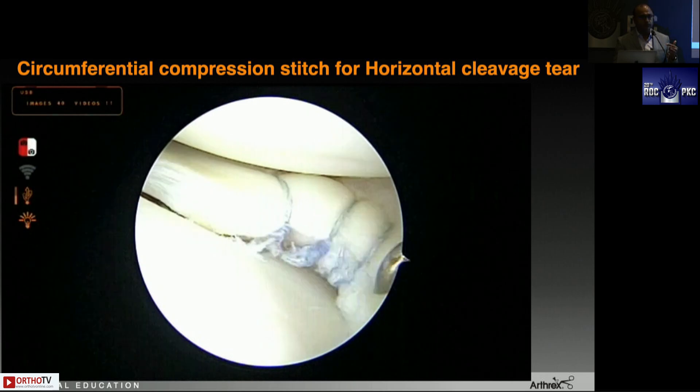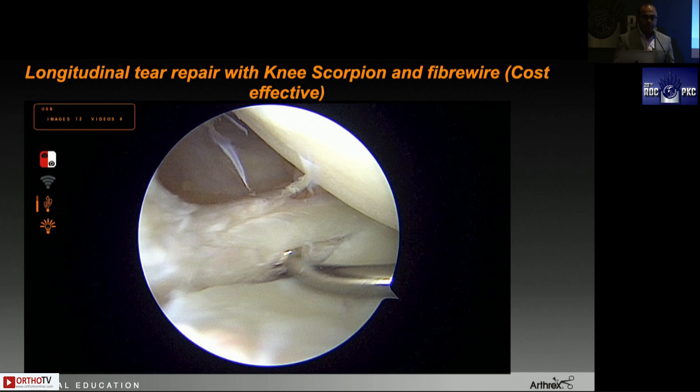A third indication is a longitudinal tear. Orient yourself: this is the left knee, visualizing from the anteromedial portal — there's an ACL tear so you've gone from the anteromedial portal into the posterolateral corner. That's the lateral meniscus near the root — longitudinal tear. These repairs are very difficult even with all-inside devices because the vessels are right behind the root. When using all-inside devices you are very concerned if the vessels are nearby — you even need to check the MRI for any aberrant vessel. The knee scorpion works wonders here.